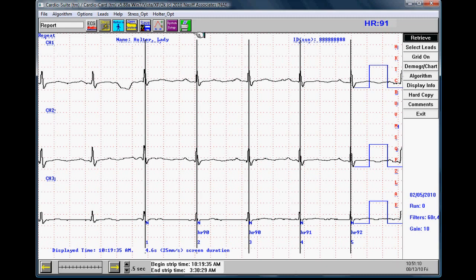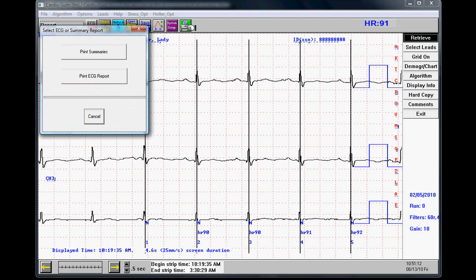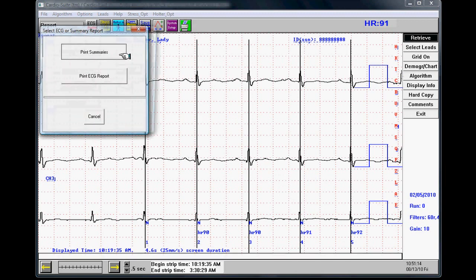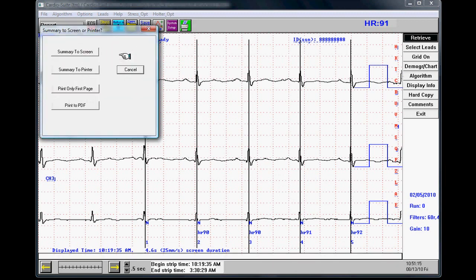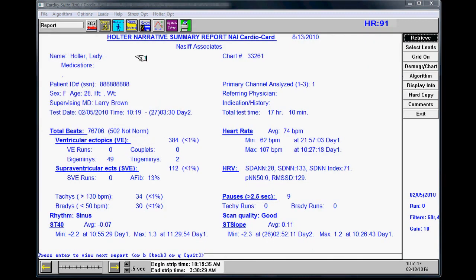After reading in the Holter and reviewing the best channel to analyze, click on the green printer, print summaries, and summary to screen.